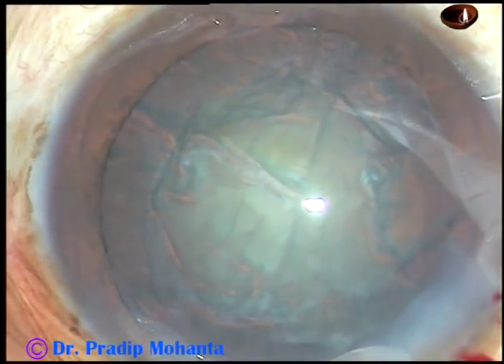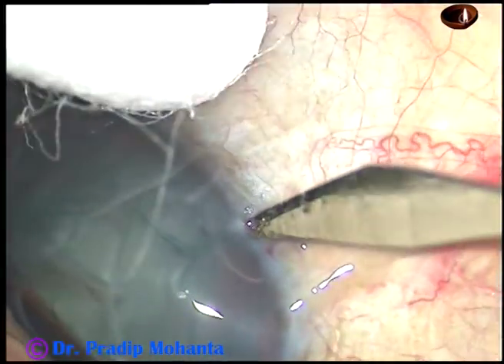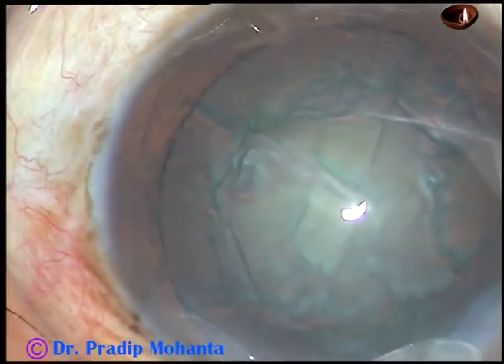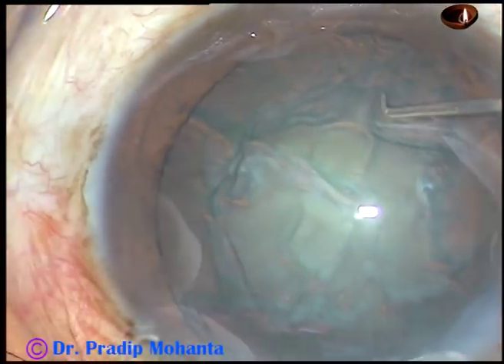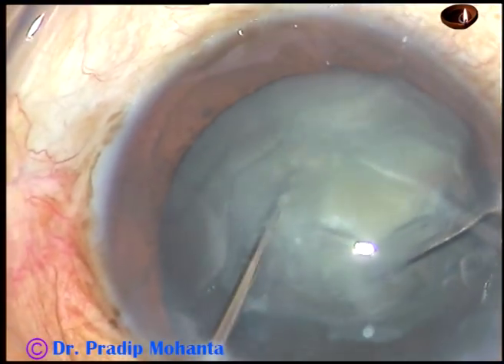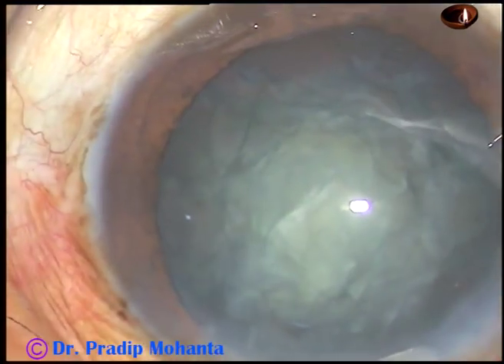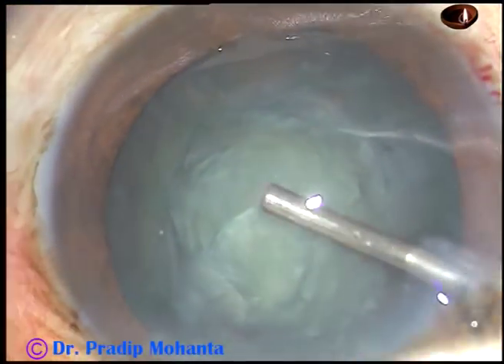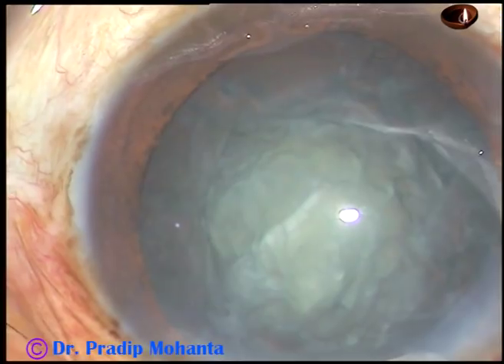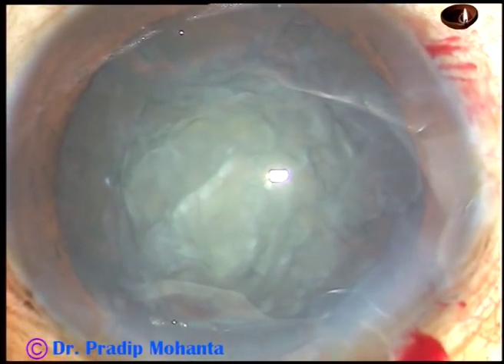So what I am doing is injecting viscoelastic substance and making one more paracentesis on the right side. Till now there was only one paracentesis on the left side of the main incision. Now I introduce two instruments — a chopper in the right hand and a Sinskey hook in the left hand — and bimanually I can rotate the nucleus. This is very important because there is a CTR in the bag, and unless I rotate it beforehand I may have a very difficult situation during nucleus management.